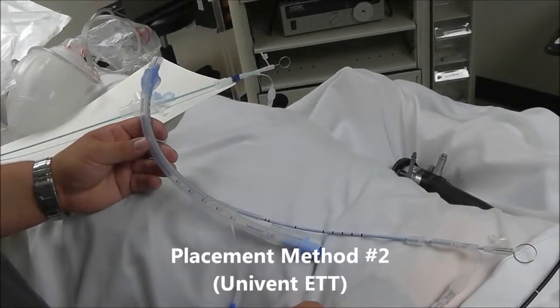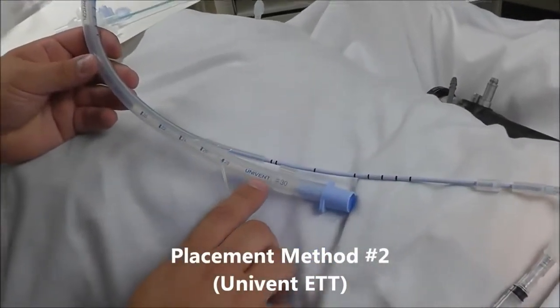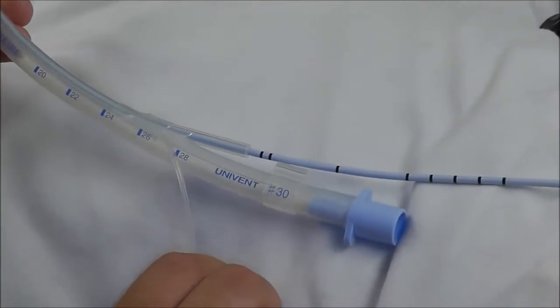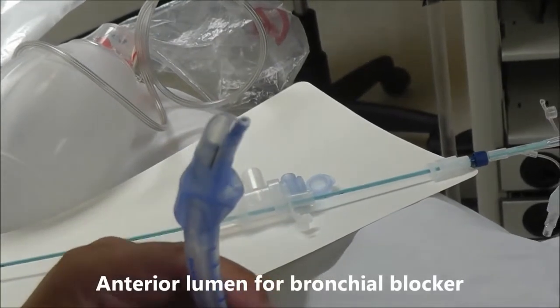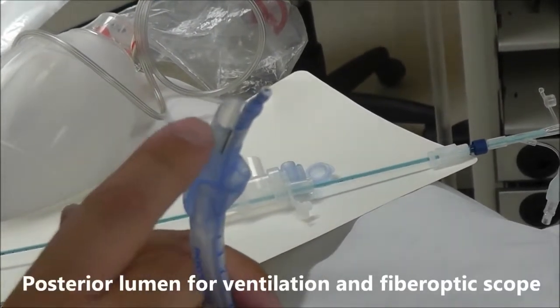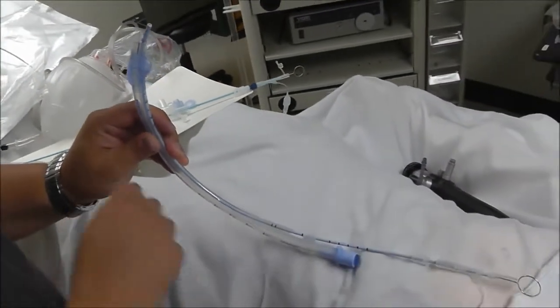Another method of placing a bronchial blocker is using a specialized Univent endotracheal tube. The difference about this endotracheal tube is that it has 2 lumens. One lumen is dedicated for the bronchial blocker. The other lumen is used for ventilation as well as the fiber optic scope.